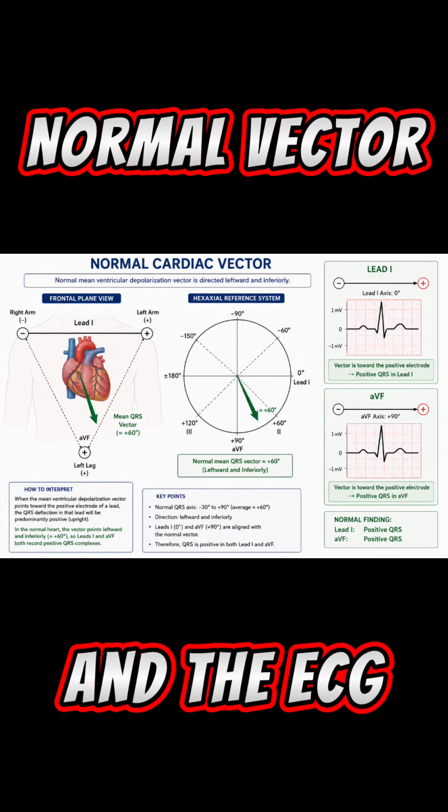Now that we know what a cardiac vector is, we're going to look at how to apply it to an ECG. It's important to remember that when the electrical impulse is traveling towards a positive electrode, it is going to create a positive QRS on your ECG. For interpretation for this episode, we're going to use lead 1 and lead aVF.